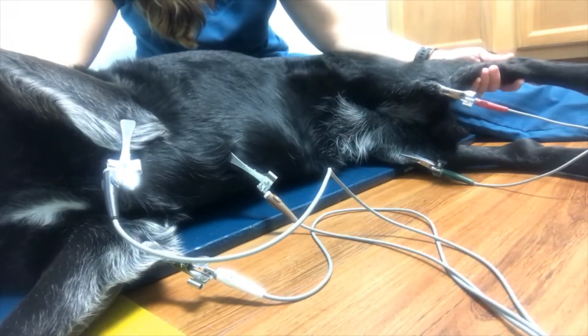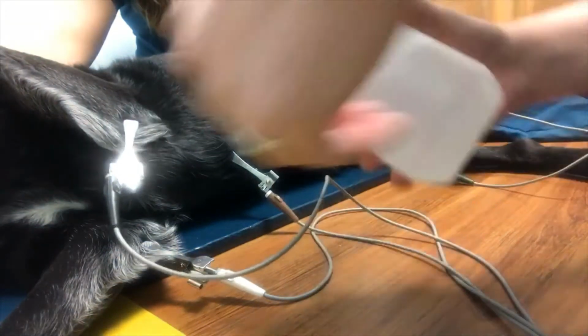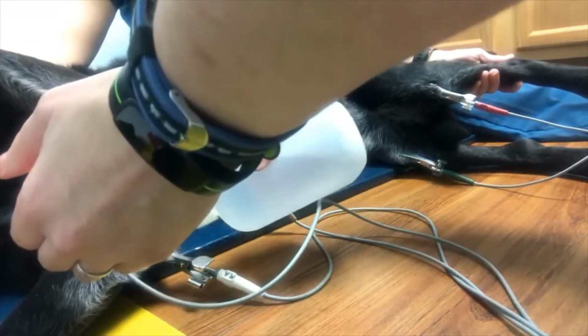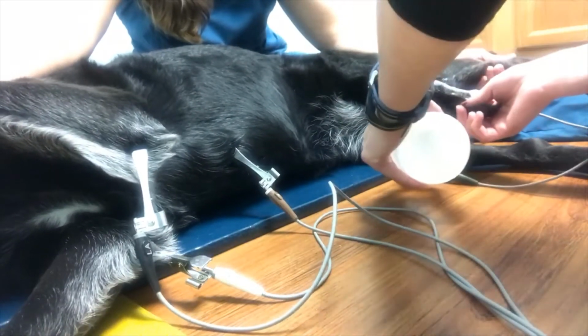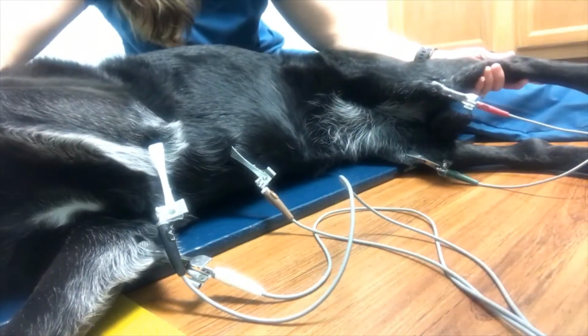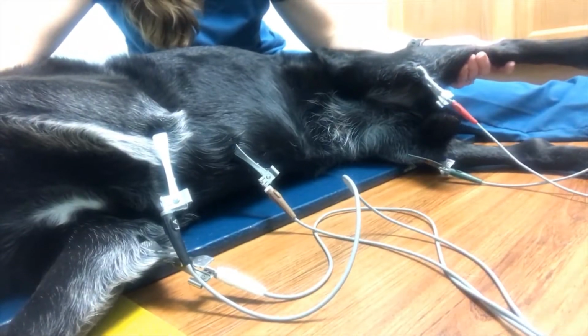It's a good idea to help minimize artifacts. We just use a little bit of alcohol to put on each location. That just helps with the contact and minimizes the artifacts. And now that we are in position, get our machine going here.